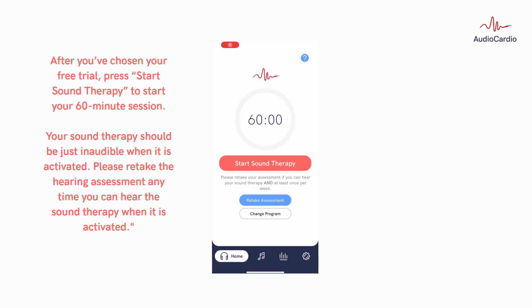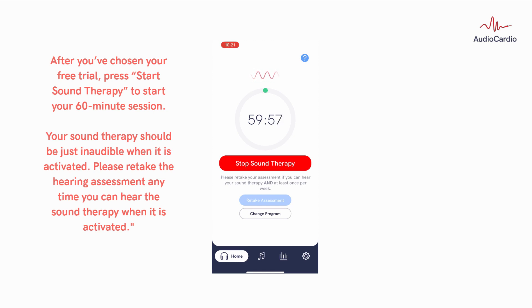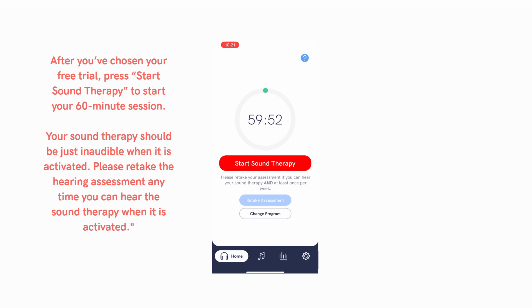After you've chosen your free trial, press Start Sound Therapy to start your 60-minute session. Your sound therapy should be just inaudible when it is activated. Please retake the hearing assessment anytime you can hear the sound therapy when it is activated.